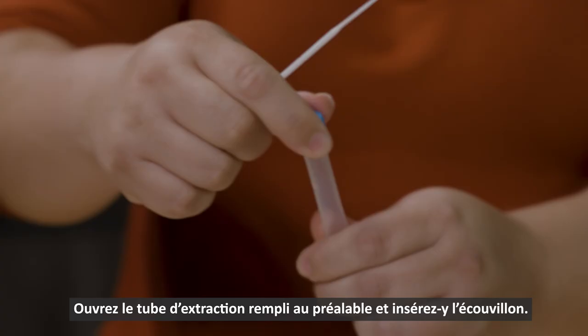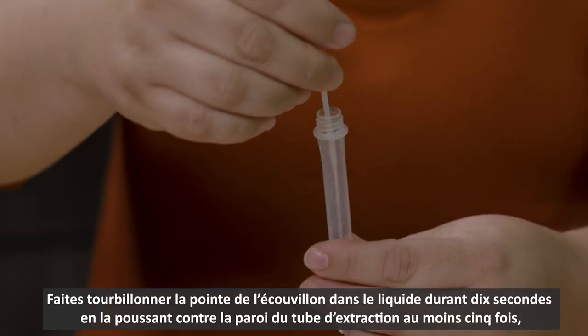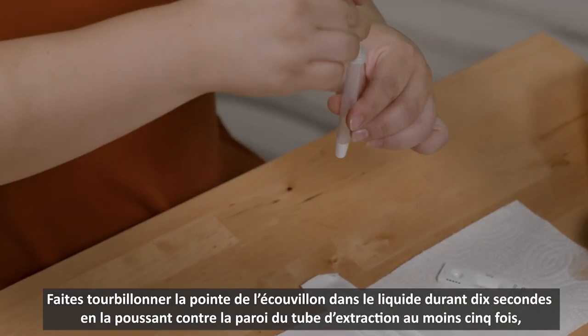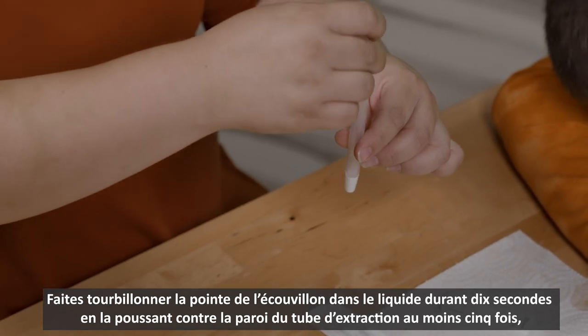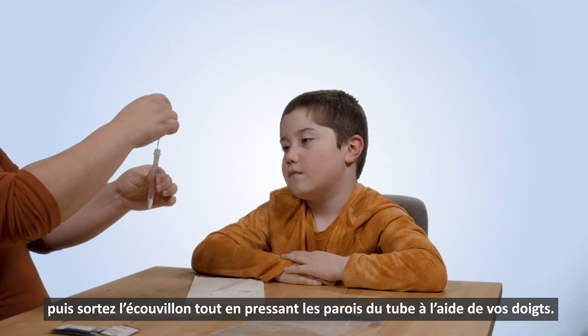Step 2. Open the pre-filled test tube and insert the swab. Swirl the swab tip in the fluid for 10 seconds, pushing it into the wall of the extraction tube at least five times, and then squeeze out the swab by squeezing the tube with your fingers.